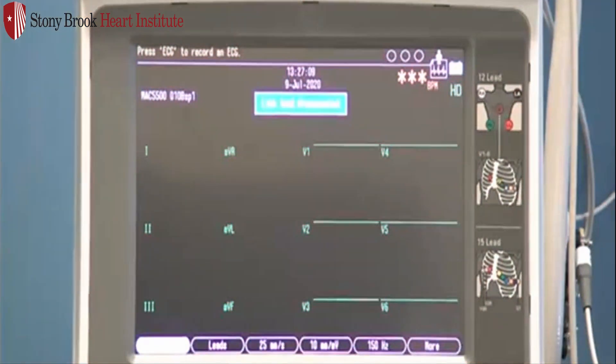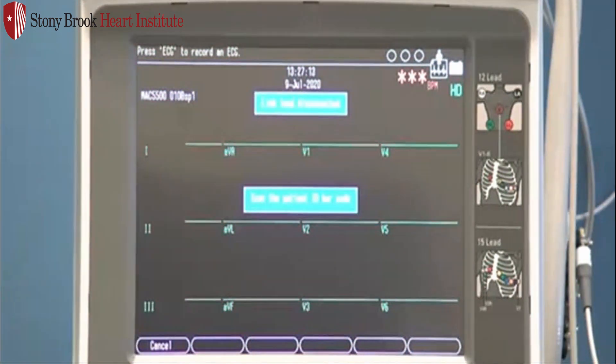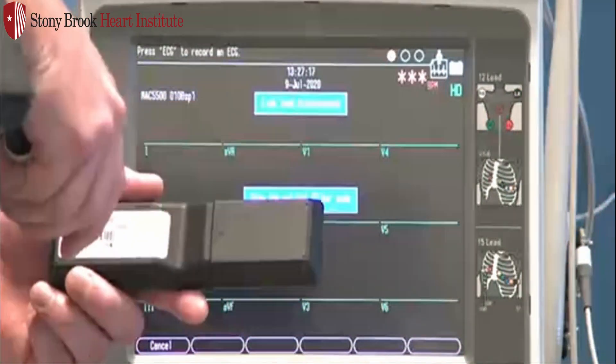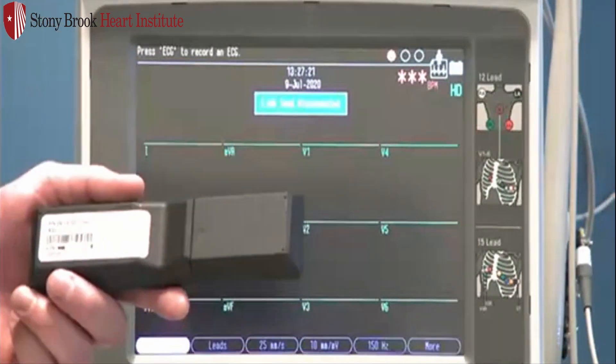To start your ECG, press Patient Data or F1. It's going to prompt you to scan the patient ID or the barcode. I have a sample here. Simply place the barcode scanner close to the barcode, press the button, and slowly pull away.